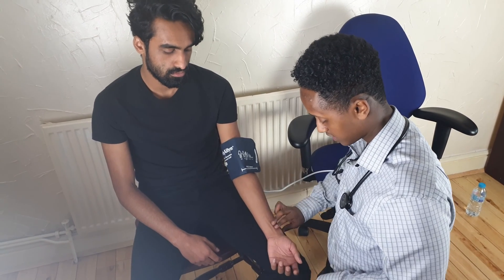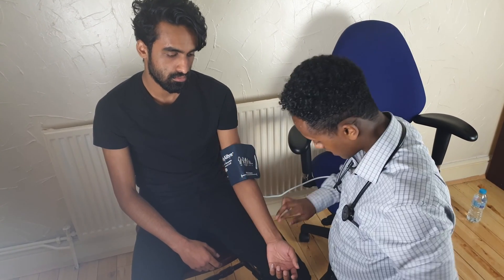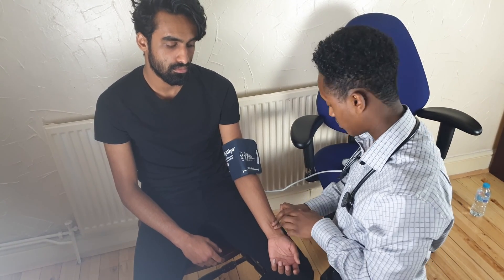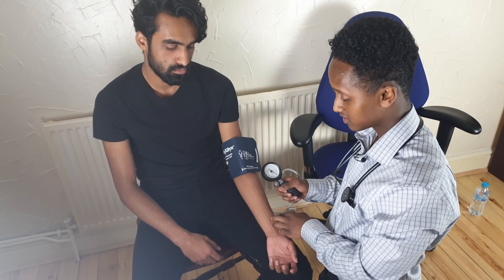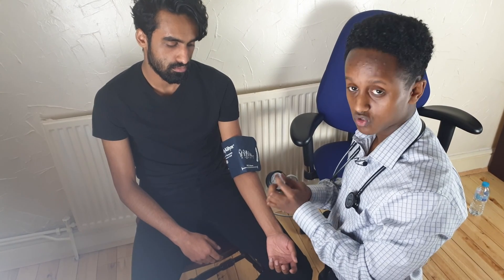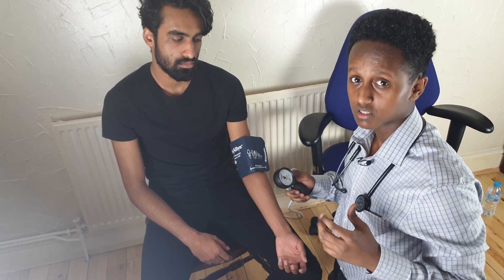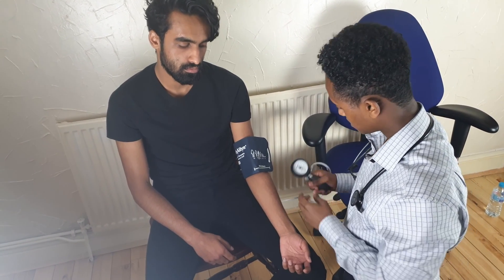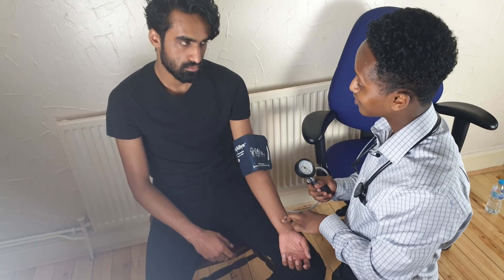The first part of the reading done at the GP is feeling your pulse. Anyone can really do that — it's the radial pulse, just below your thumb in that groove. Put two fingers there and you can feel the pulse. What the doctors do is keep squeezing until they don't feel it, and that gives you the upper estimate of the systolic value. As you saw in my previous video, the systolic value is the pressure the heart uses to pump blood around the body when it contracts.